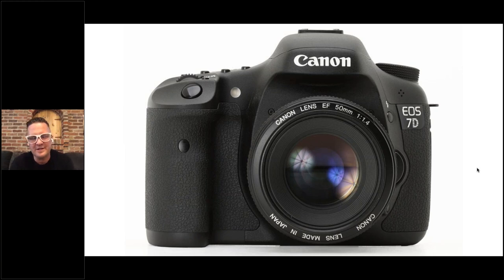You guys know a lot of what we do is very detailed. So you need a camera that can take a macro shot of something very detailed and save yourself some time. Talking about timing, that time is going to be a theme throughout this whole thing. But you basically can save yourself some time by sharing exactly what you're seeing with your doctor instead of trying to explain it to him over the phone.